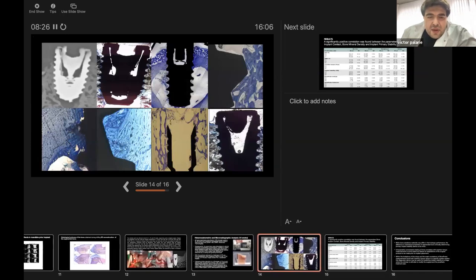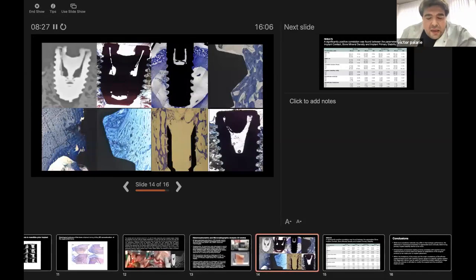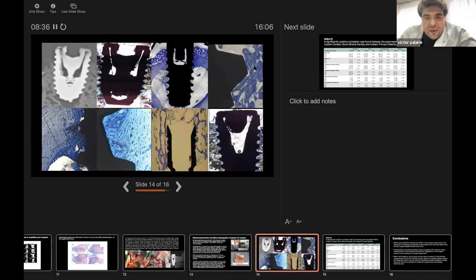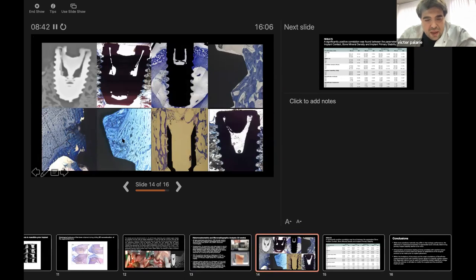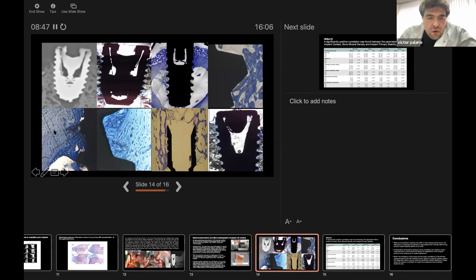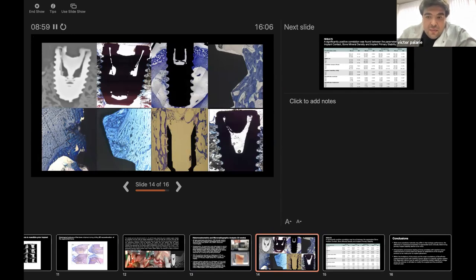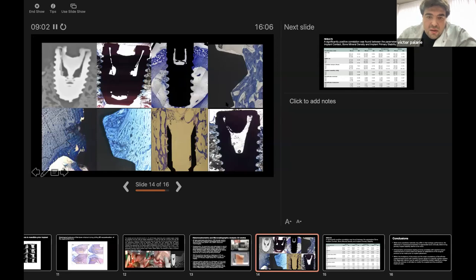Here we have some radiological pictures in comparison with histological sections. We paid special attention to the contact of the body of the implant to the new bone, as well as formation of new bone around the body of the implant, and the possibility of microfractures of the bone during implant insertion. Very important, we studied the part where the implant was not fully covered in the bone and examined the vertical bone formation around the neck of the implant.